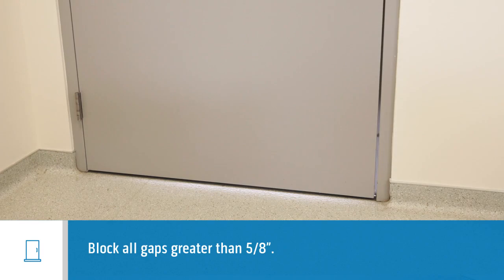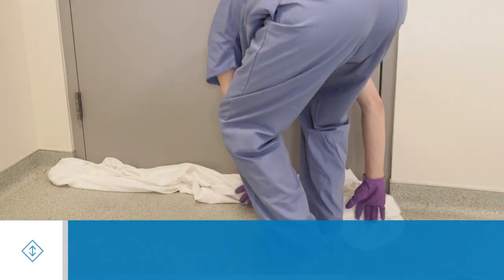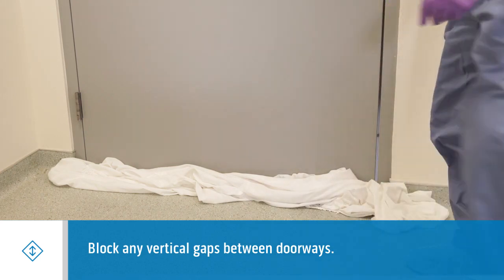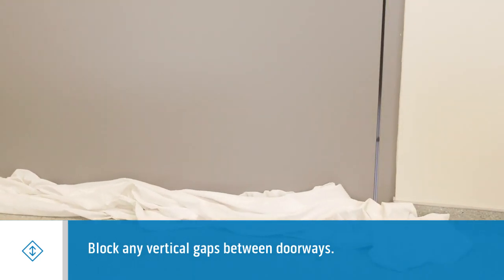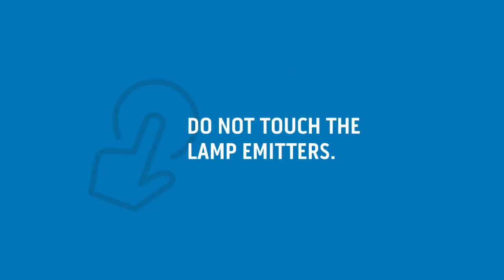Block all horizontal gaps between the floor and the bottom of the door greater than a quarter of an inch. Likewise, block any vertical gaps between doorways through which visible light travels, using a non-permanent tape like painter's tape. Finally, don't touch the lamp emitters — oil from your hands will lower the life of the lamp.